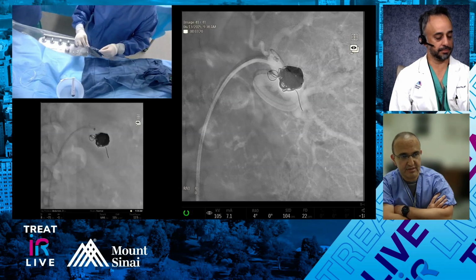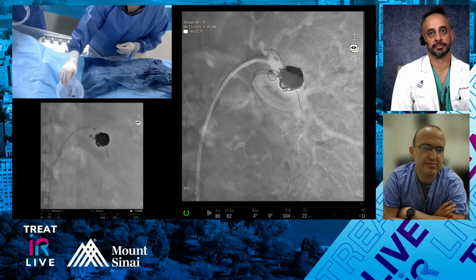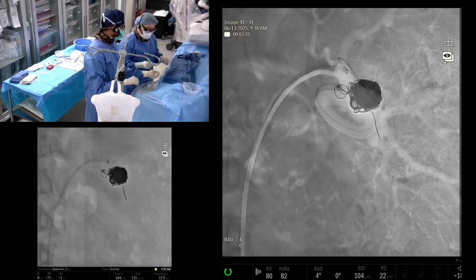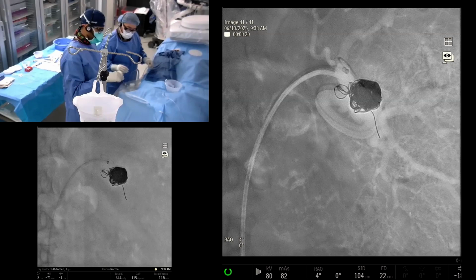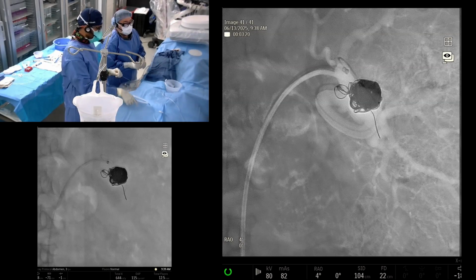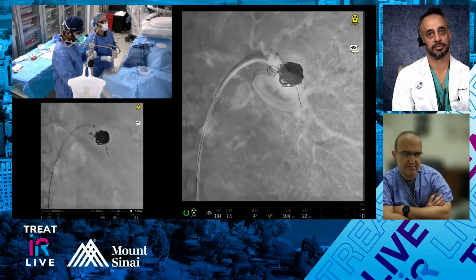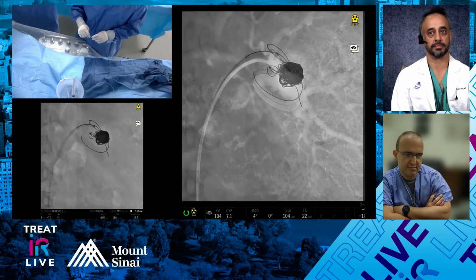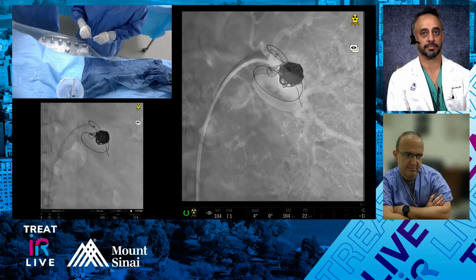So just to let you guys know, I'm at the origin of this splenic artery aneurysm, just at the proximal inflow vessel. I'm going to put a nice little coil in the inflow vessel and call it a day. We'll probably be deploying our last or second to last coil. What size are you using for the inflow? We measured on the CT about 7.5 millimeters. Here it is coming. The tip is right at the inflow here. So we pulled an 8.